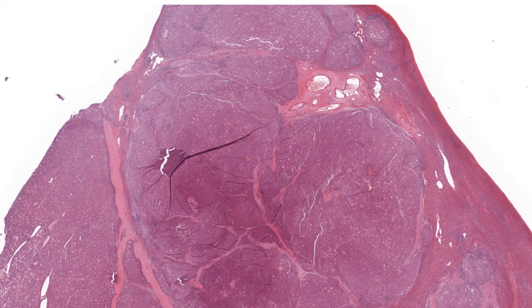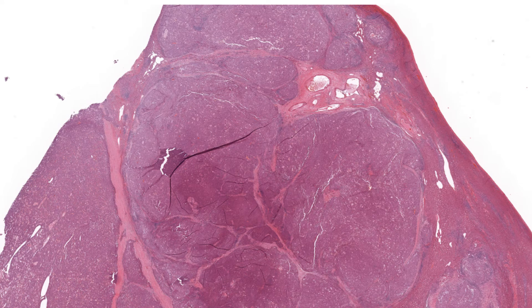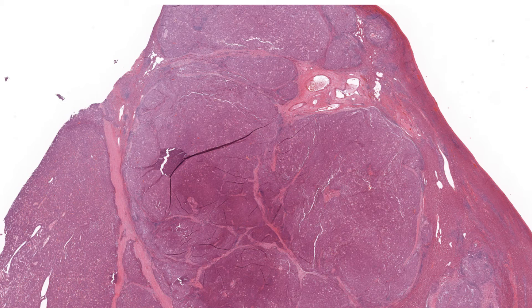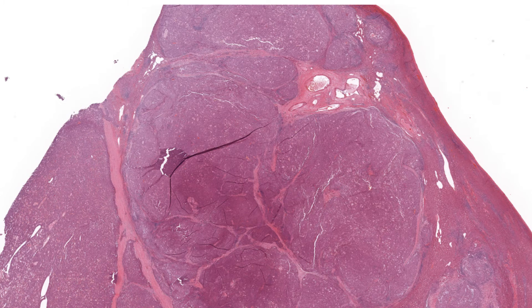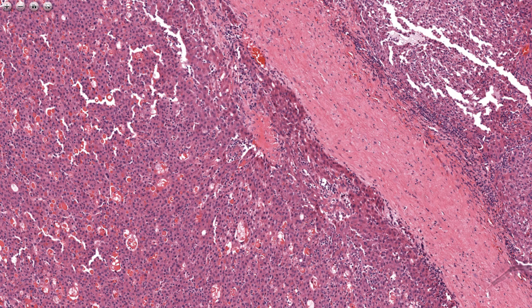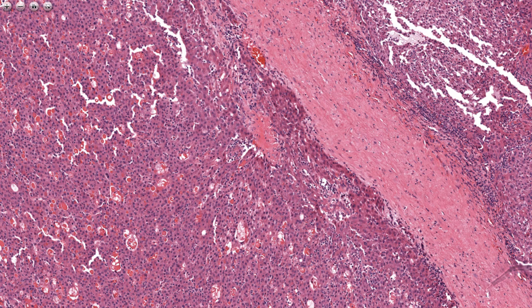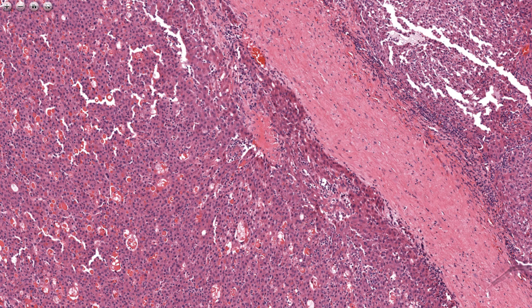Case four at very low power: there are fibrous septae that don't look lamellar, and there isn't as much fibrosis as in case one. The fibrosis lacks that lamellar quality. The cells do have abundant eosinophilic cytoplasm, but they lack that classic pseudoglandular pattern — and that pseudoglandular pattern is so typical of fibrolamellar carcinoma.